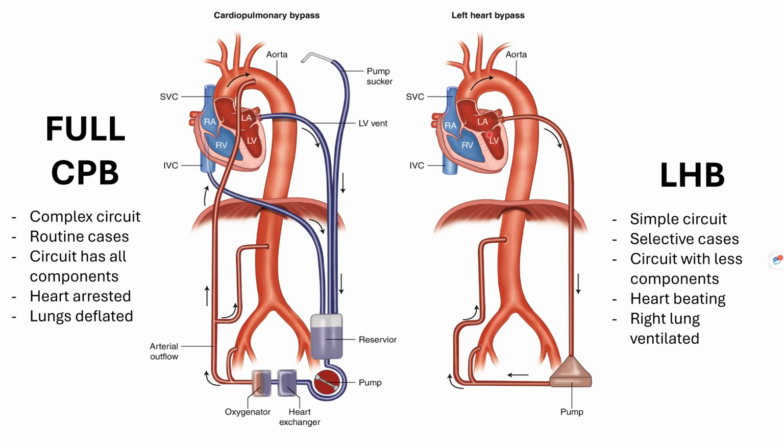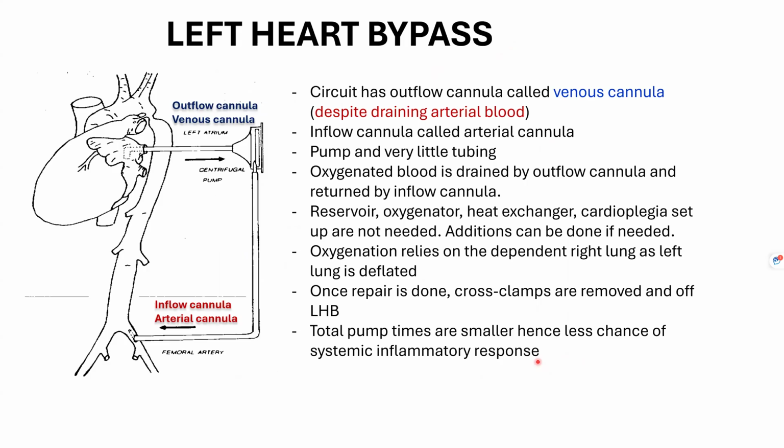So it's oxygenated blood. And you are not draining all of the blood. You're just taking a part of blood or a portion of blood. So it's a very simple circuit, and your heart is beating and the lung is also being ventilated.